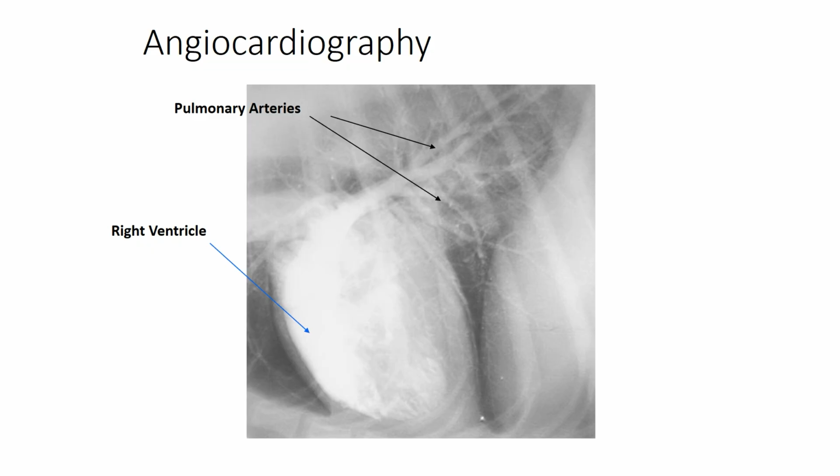This is a lateral view of angiocardiography. You can clearly appreciate the pulmonary arteries and the right ventricle.